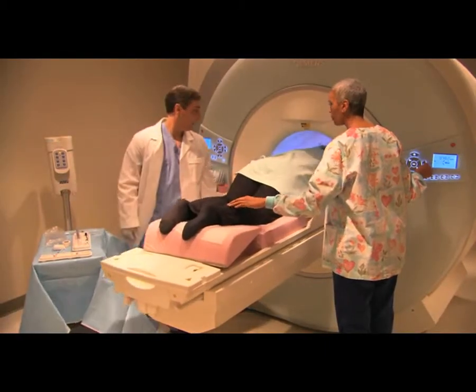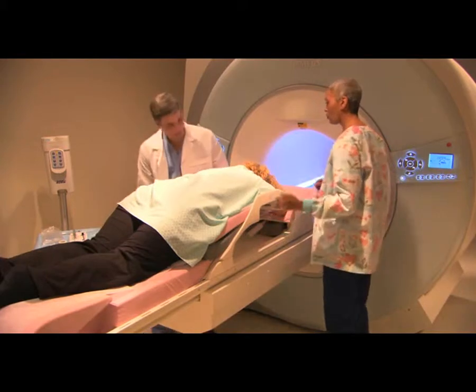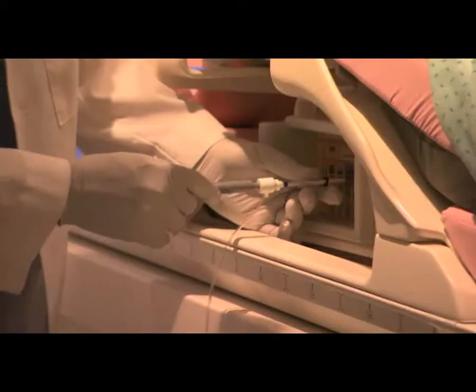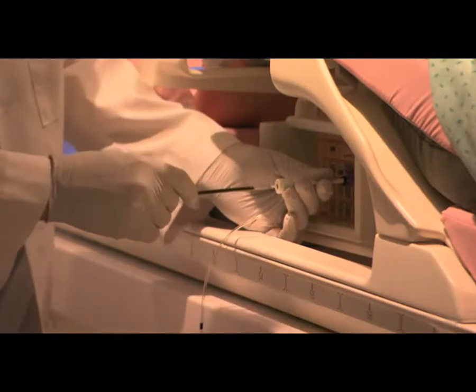These images will help guide your physician to the exact spot where the tissue sample needs to be taken. Next, your physician will come into the room and explain what's happening. They will clean and numb your breast prior to making a small incision, and then place a targeting tool called an obturator, which visibly confirms positioning in the MRI scan.